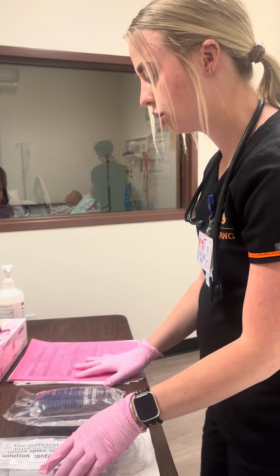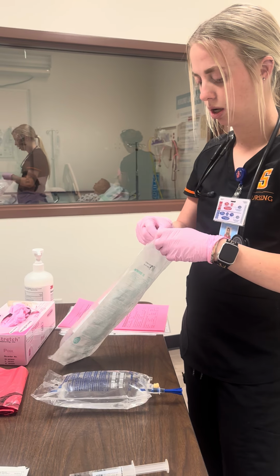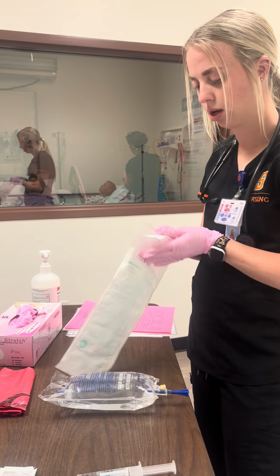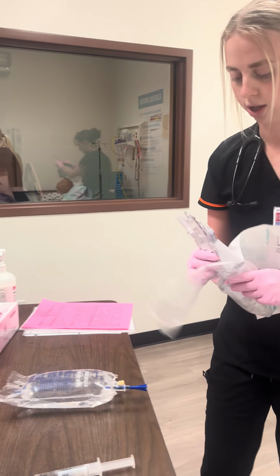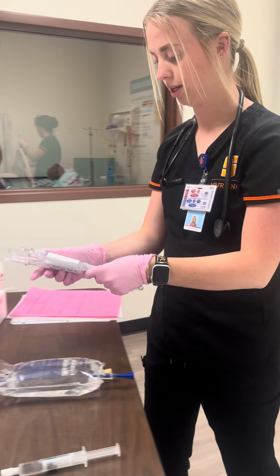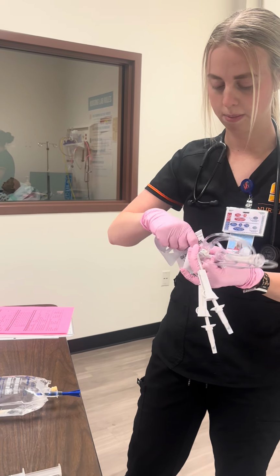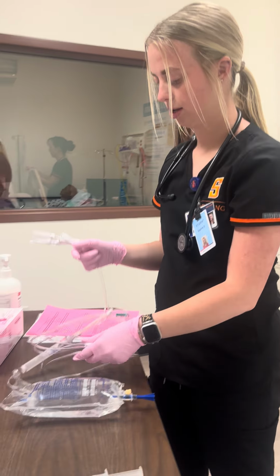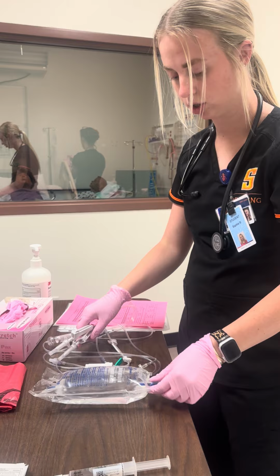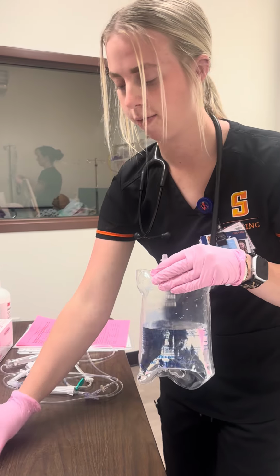I'm ready now to open my tubing and set up my normal saline. I'm going to make sure that I remember every bit and piece that needs to be remembered with the transfusion. I would spike a new bag for sake of practice.